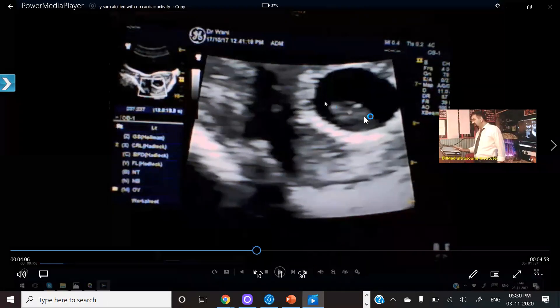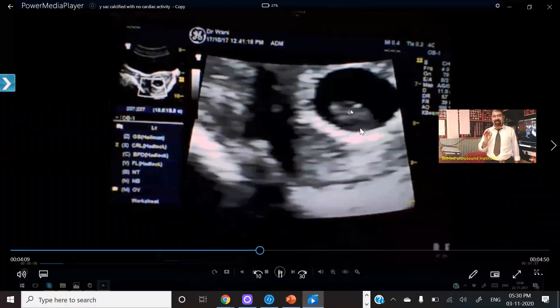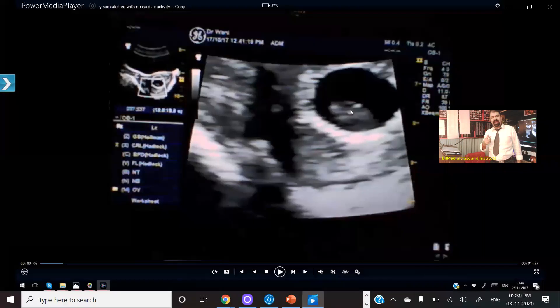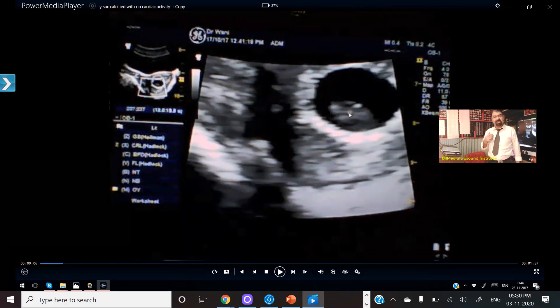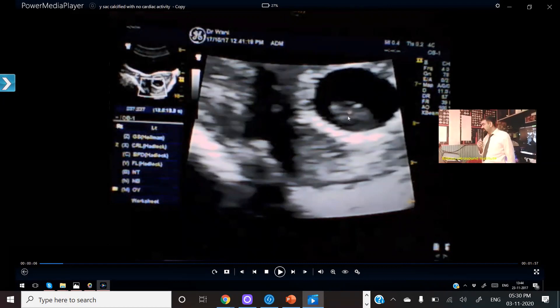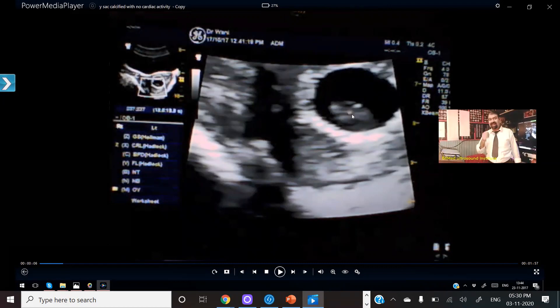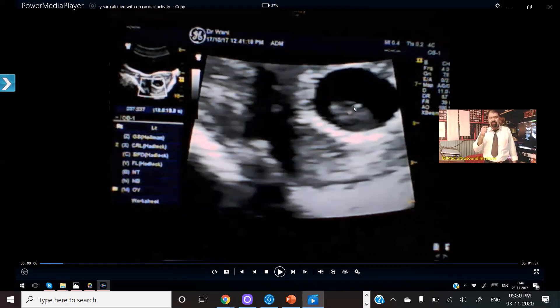In this fetus, what I am missing is the fetal cardiac activity. I am confused whether the cardiac activities are there — maybe there are some muffled fetal heart sounds, or maybe I am dealing with transmitted pulsations, the maternally transmitted pulsations. Then how to confirm this is a dead fetus? Go to the yolk sac. I am giving you one important point: go to the yolk sac and ask the yolk sac.